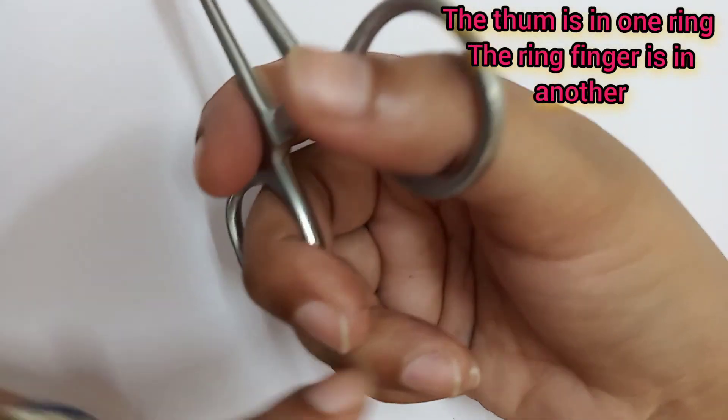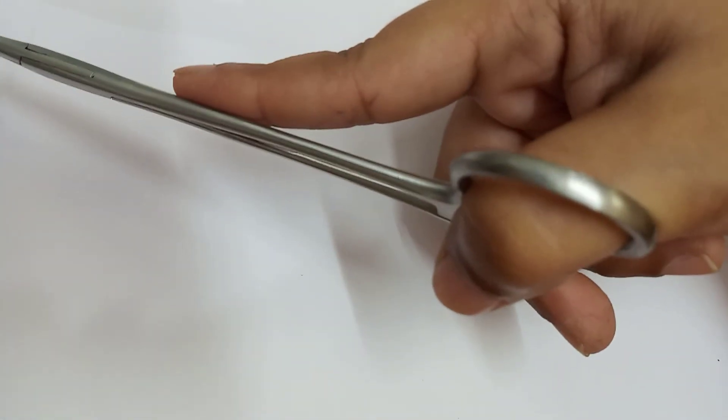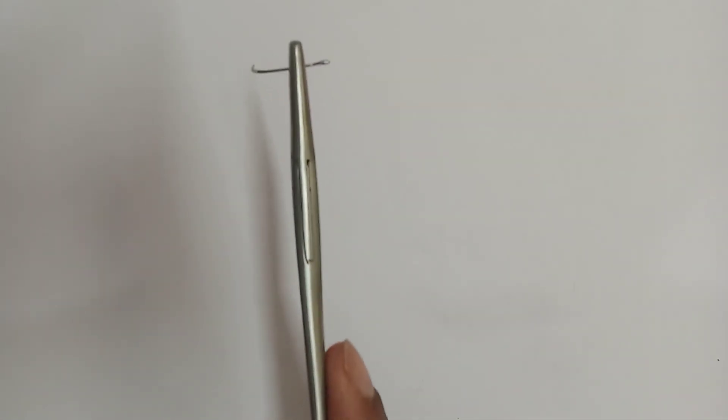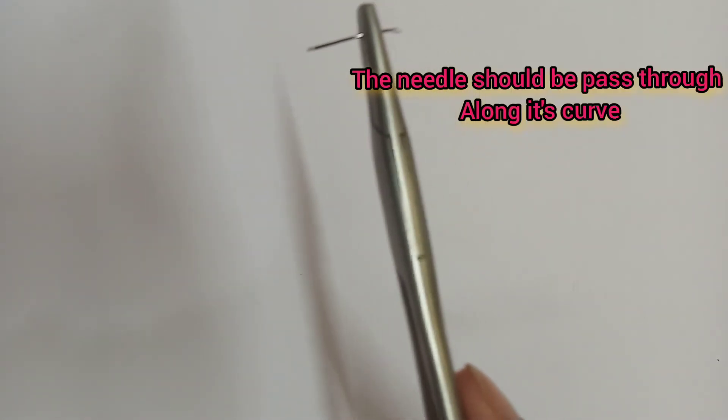How to hold the needle holder: the thumb is in one ring and the ring finger is in the other, with the index finger positioned along the holder for stability. The second principle is that the needle should enter the tissue perpendicular to the tissue surface. The needle should then be passed through the tissue along its curve.